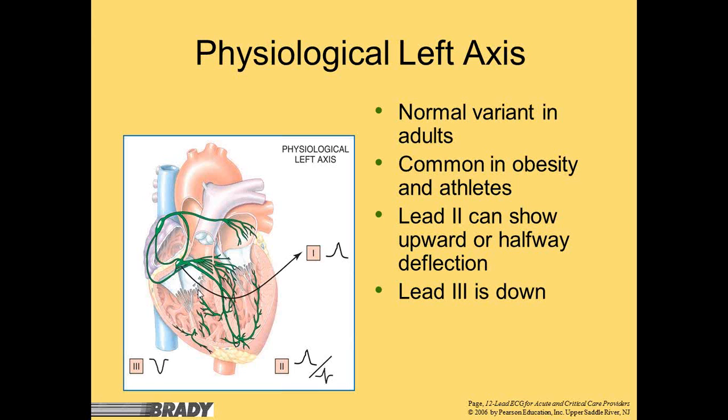And I can see where sometimes this heart muscle under stress with the athletes can become a little bit hypoxic there, causing that deviation. And the same thing maybe with our obese people, not so much the oxygen demand, but the unhealthy state of the heart may cause a little bit of ischemia in those heart tissues, which causes this deflection.